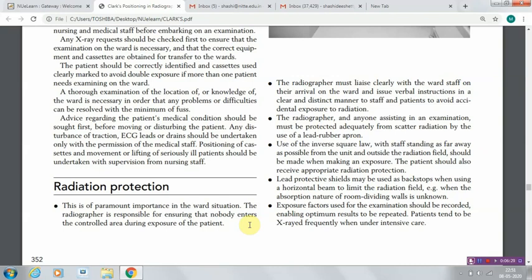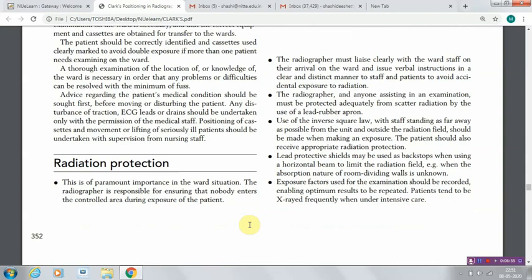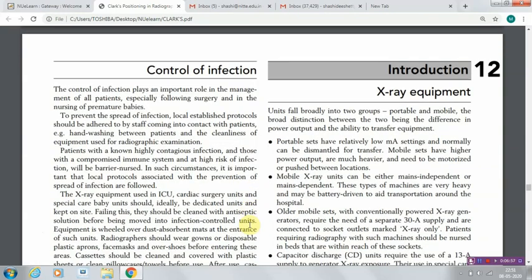Mobile radiography is heavy, where you should use a roller to move it, and you can take a bigger exposure in certain radiography. Portable radiography is foldable and fixable, where you can carry it yourself from one place to another. So whichever is used in the department is mobile radiography.